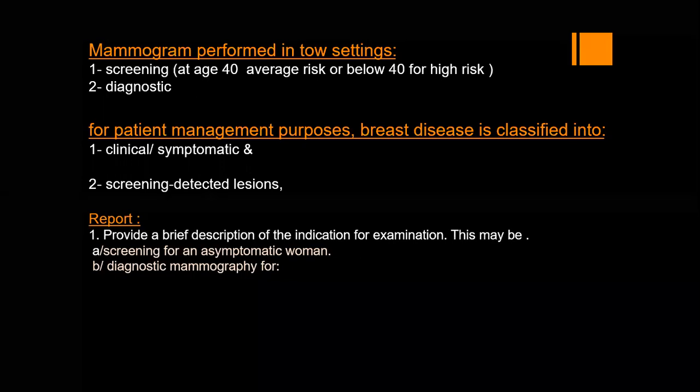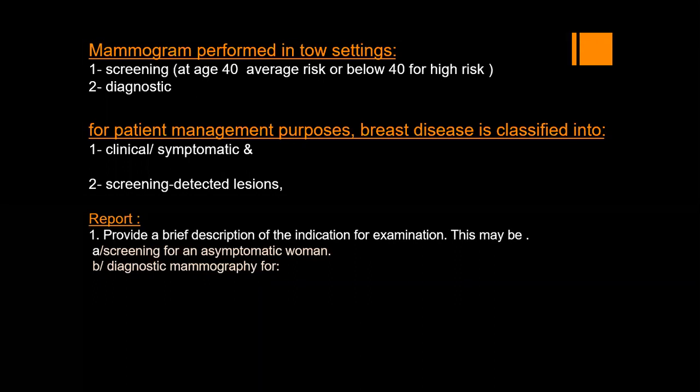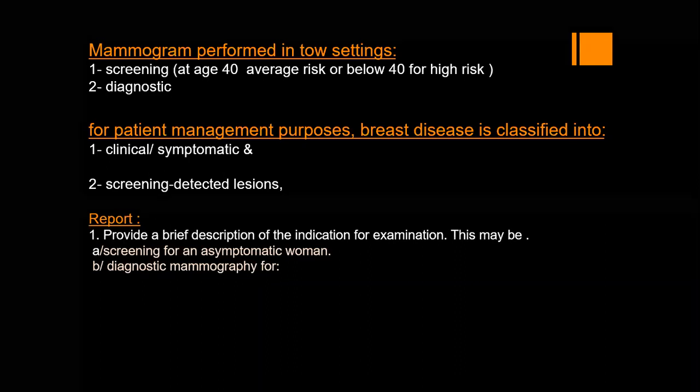What are the indications for diagnostic mammography? Do you know? When we do a diagnostic mammography, what are the scenarios for which diagnostic mammography is performed? Breast lumps, clinical abnormality or symptoms.